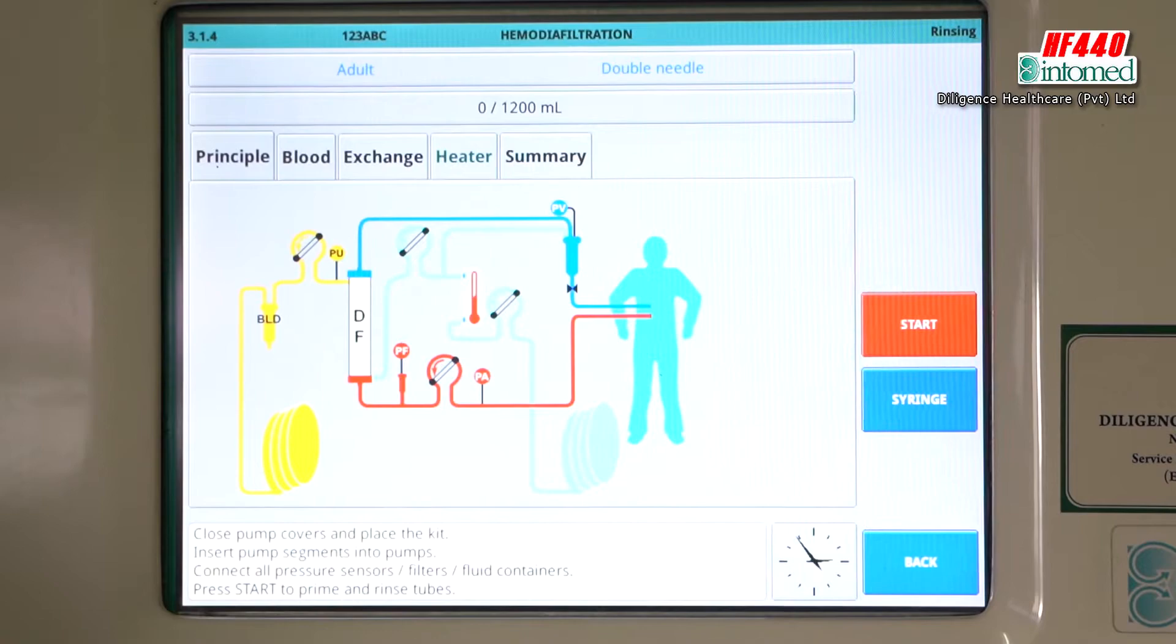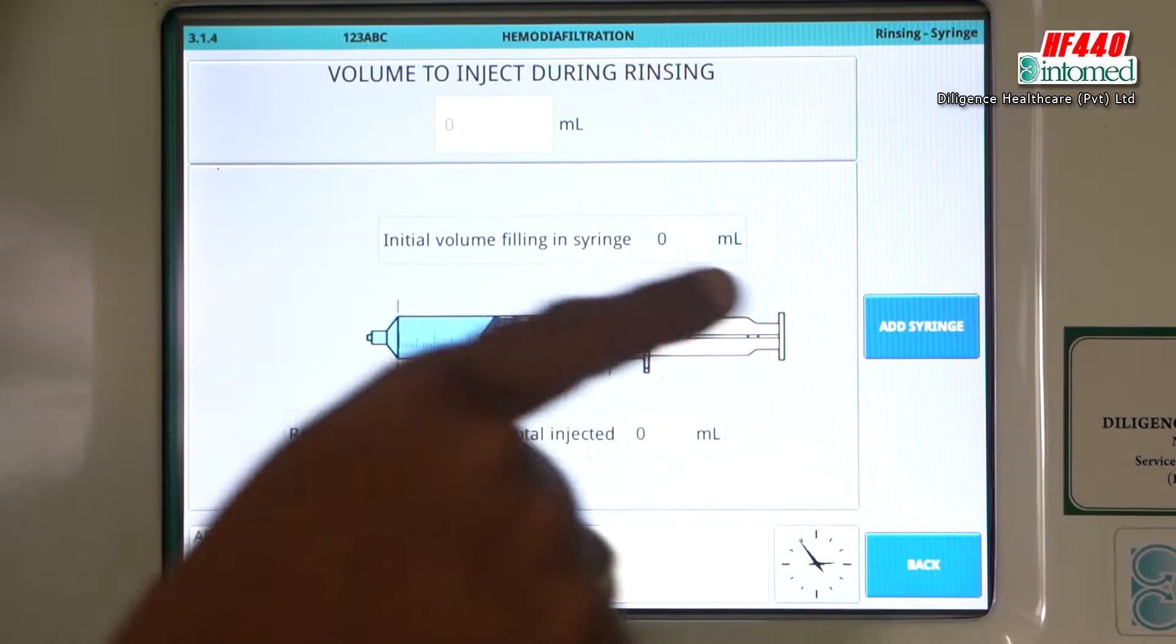Now we have to go to the syringe where we have to fix the syringe. You can see the small tube is there, very tiny tube, then very thin.